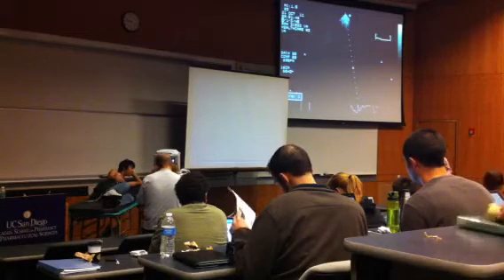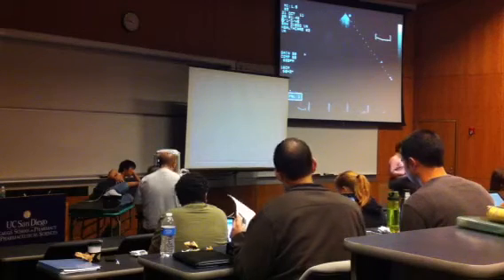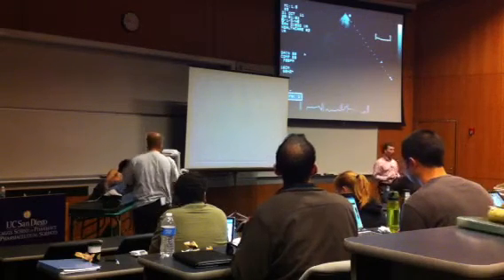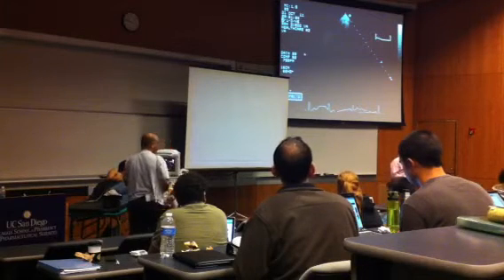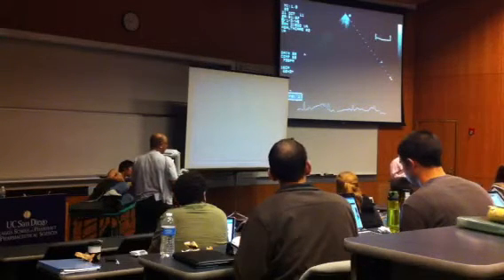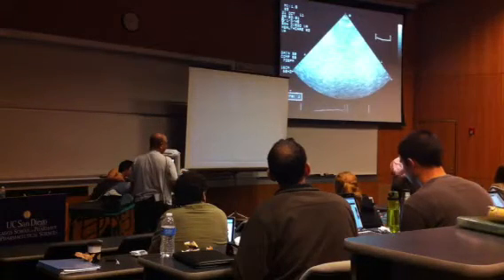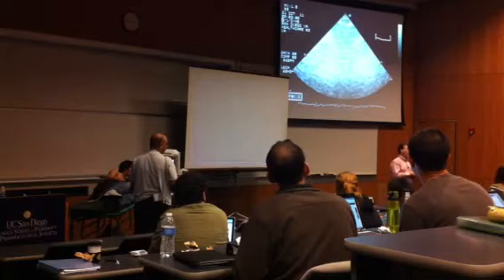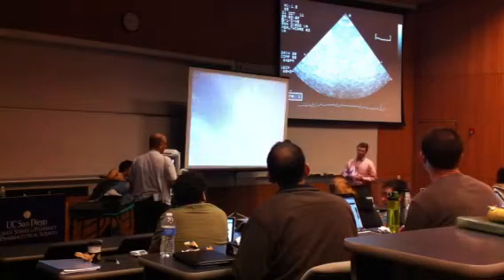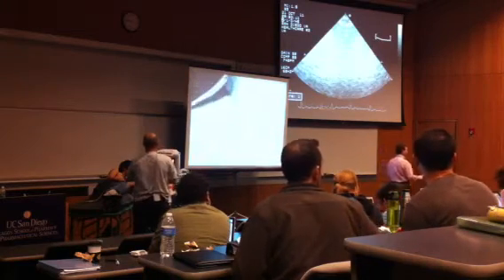As an example, we have a special echo machine in my laboratory where we can echo mice. Anyone know what a typical mouse heart rate is? When they're running around at night, which is a typical time they run around. Someone says 300. Any other guesses? About 800. Okay, so 600 to 800. So the frequency of the transducer has to be able to pick that up.